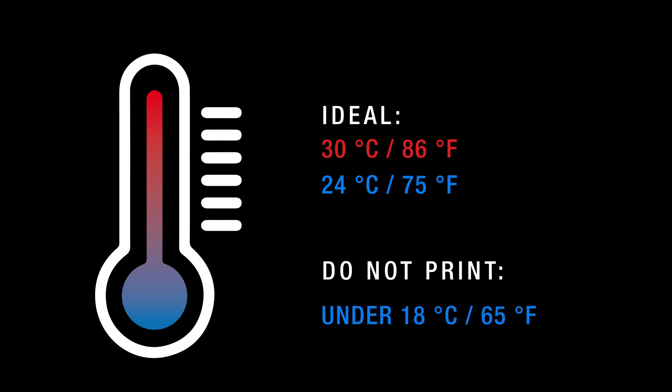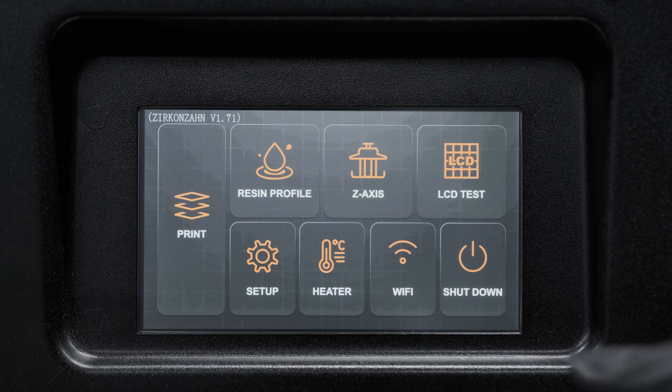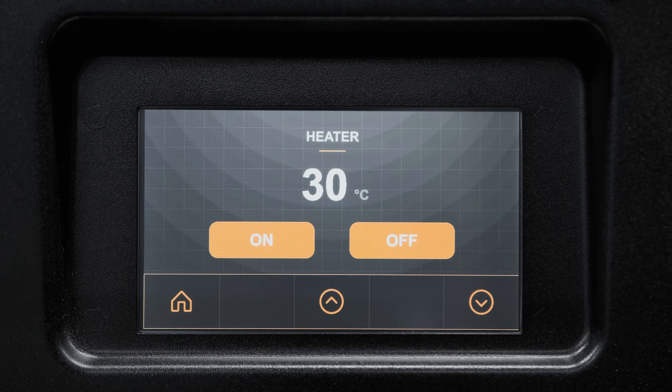Ideally print with a temperature in the chamber between 24 and 30 degrees Celsius. Do not print if the temperature is below 18 degrees Celsius. To turn the heater on, select heater and then click the button.